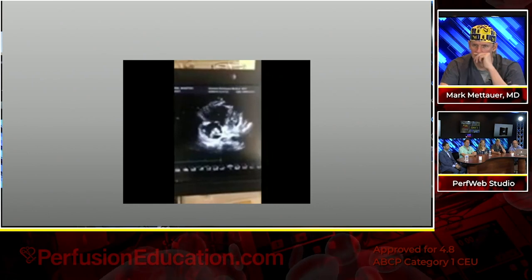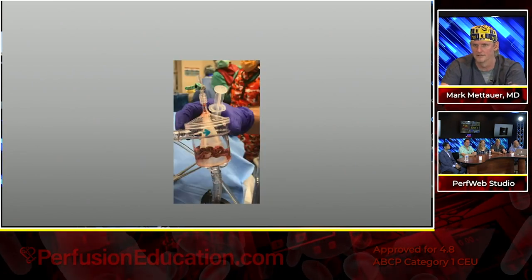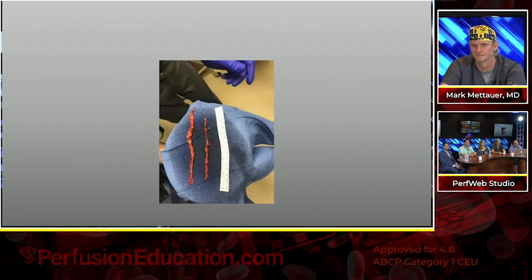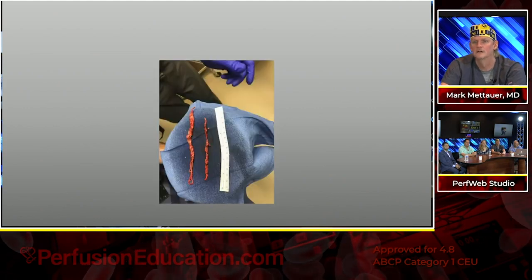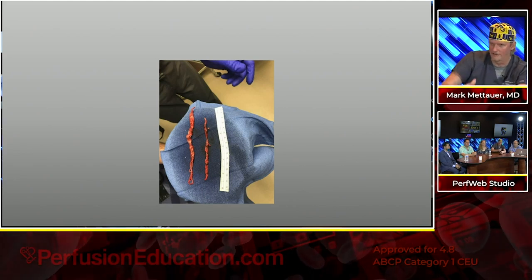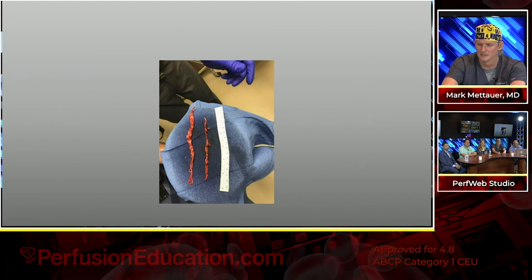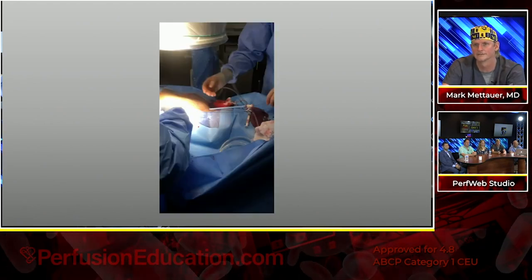I don't know what this one really wasn't going across the valve, but it was all balled up in the right atrium. And there's the specimen. There it is in the filter after we wash it out. Two nice chunks. We had to unwind this. It was actually in several knots. It looked like a big sailor's knot, didn't it? Yeah, it did. It didn't have any rhyme or reason to it, but that's what it looked like.